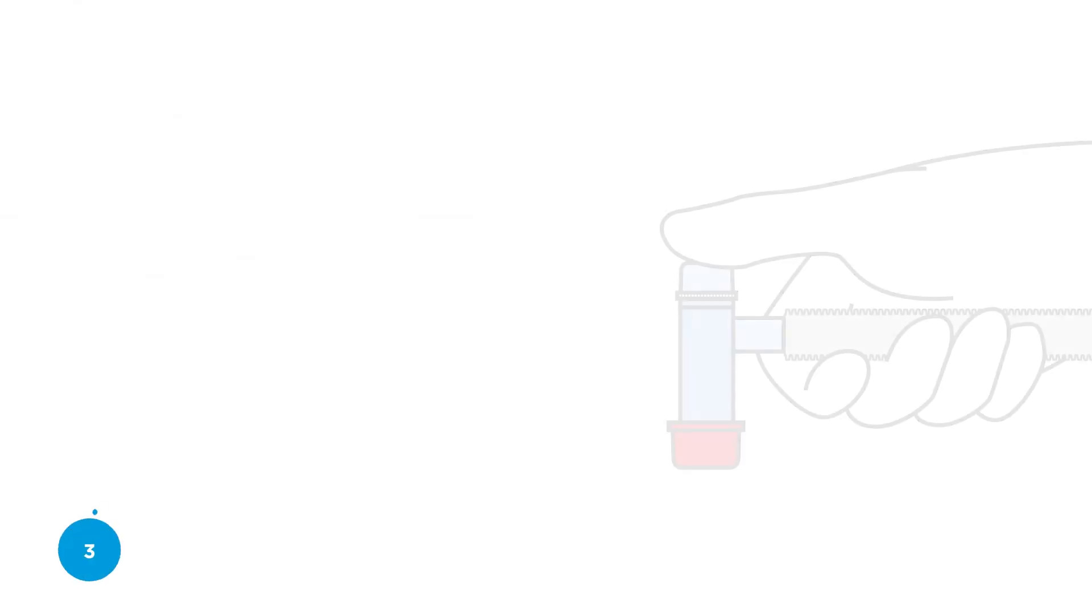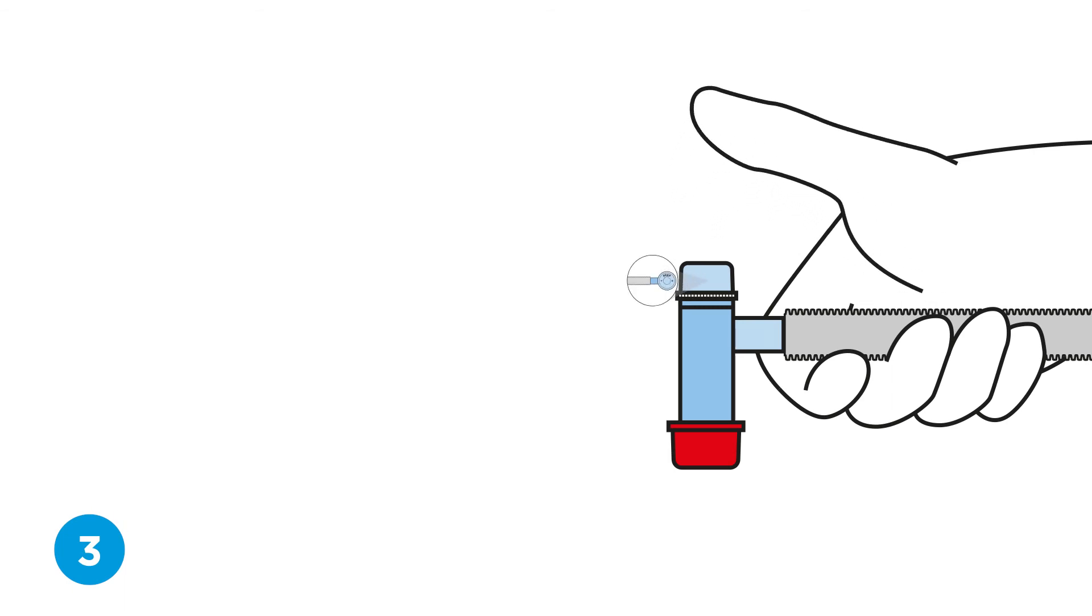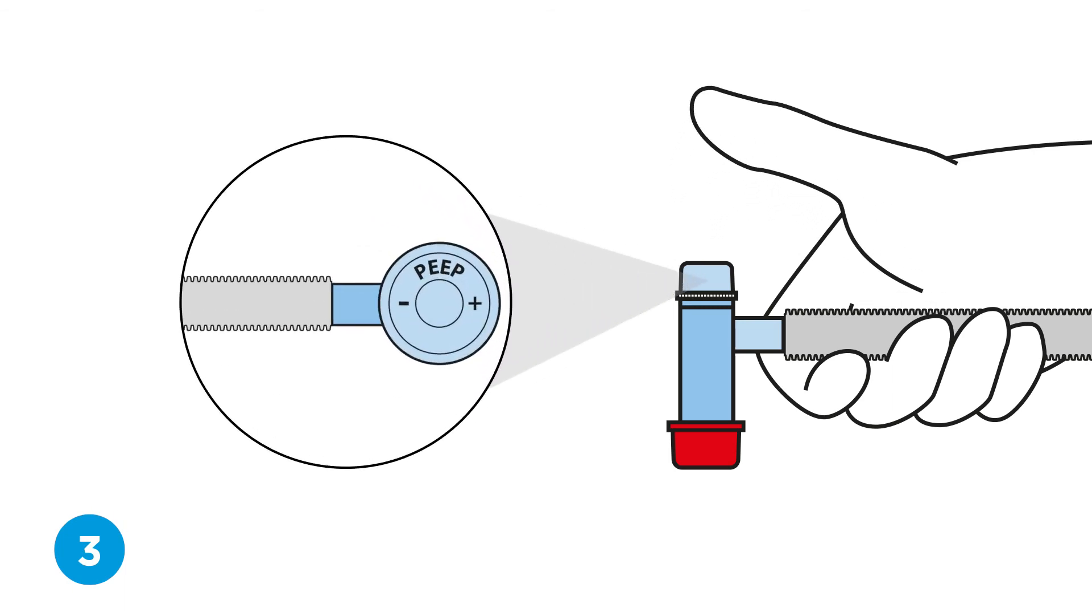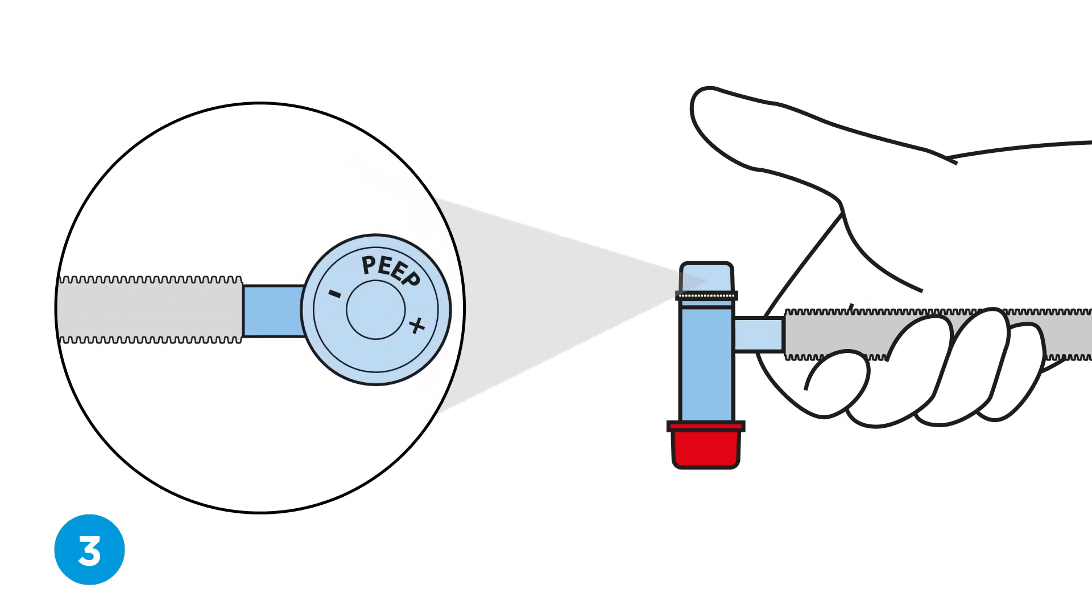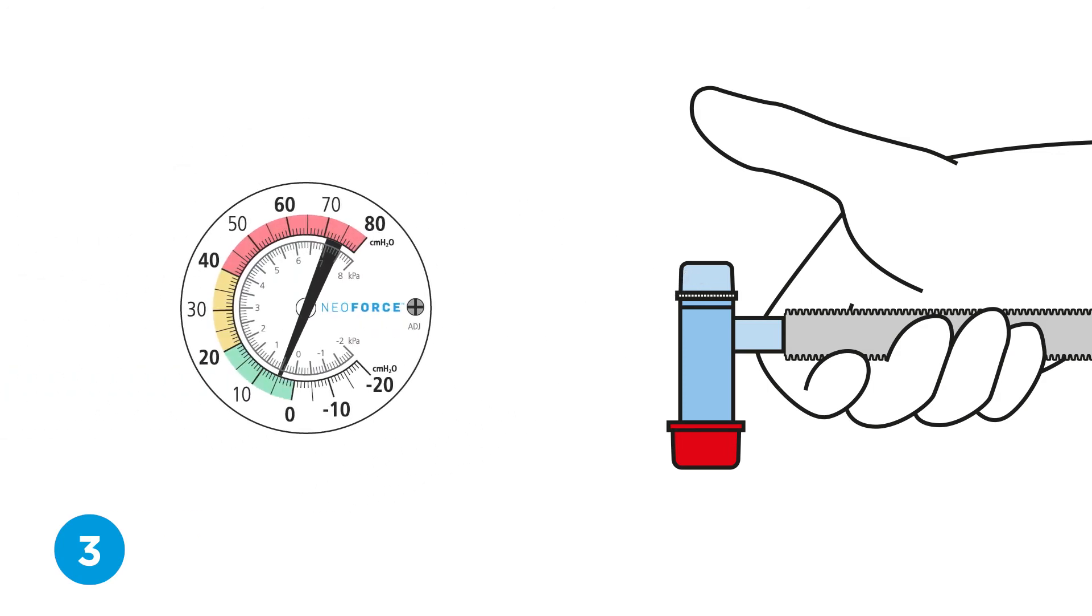Step three, set the PEEP. Adjust and set the desired PEEP level by turning the T-piece cap and verify settings on the pressure gauge.